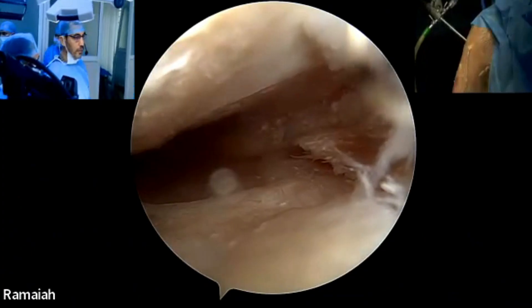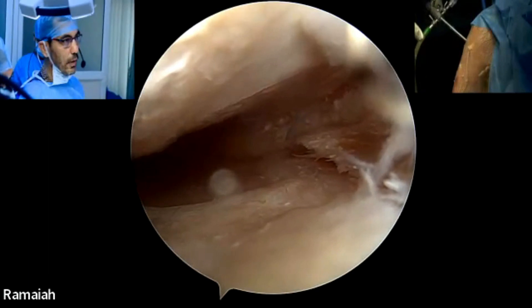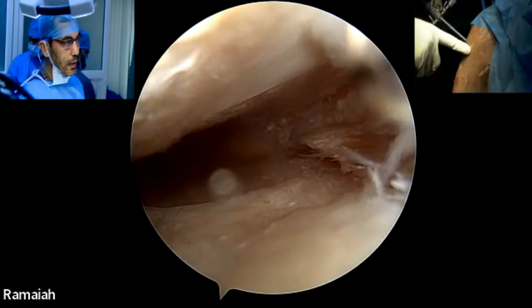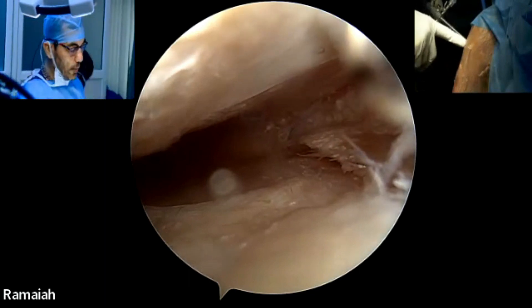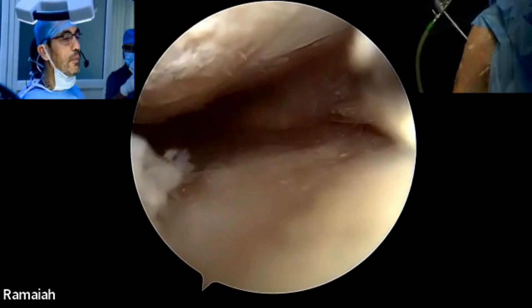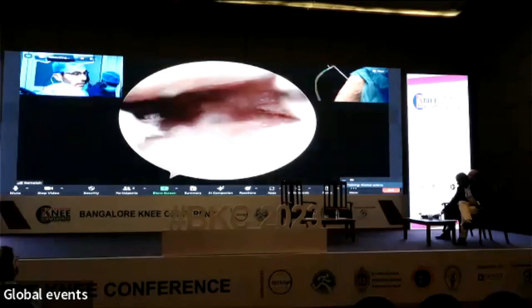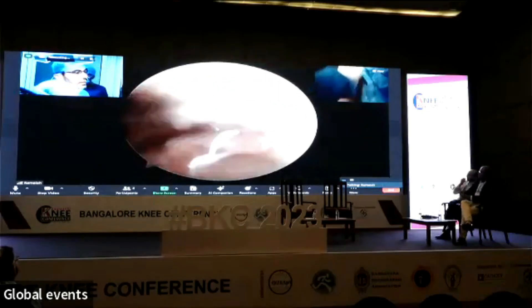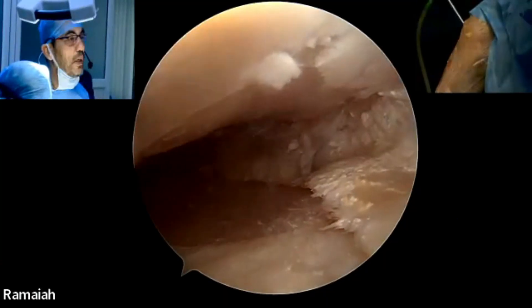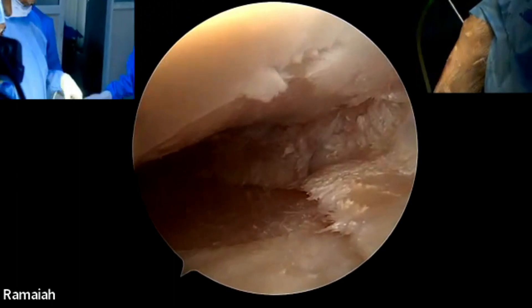I have this patient who has a little arthritic knee, with a varus deformity also. I put an anterolateral portal and anteromedial portal, and through the anterolateral portal I put the camera in. You are able to see the anterior part of the medial meniscus with some arthritis there, and the medial part of the meniscus is also seen. This is the medial side — medial meniscus — with a lot of arthritic changes and loss of meniscal tissue.